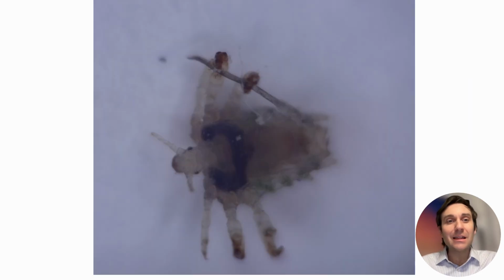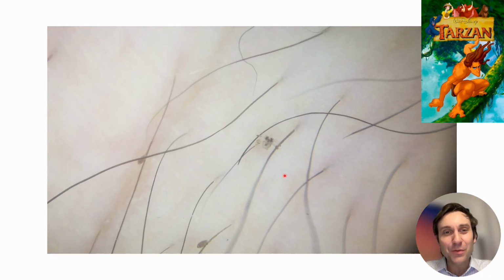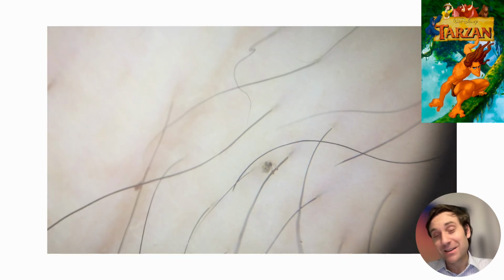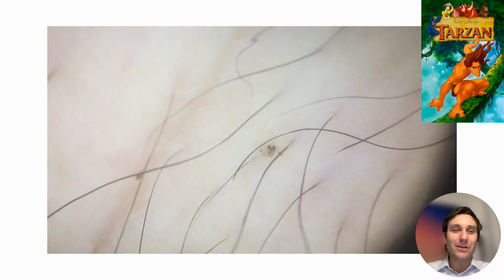Look at this. There's nothing else. There's no false positive here, right? And you even see them live here, like Tarzan, moving from hair to hair on the body of this guy. So it's very, very easy to make a correct diagnosis with your dermatoscope.